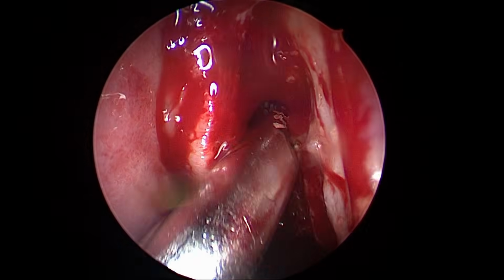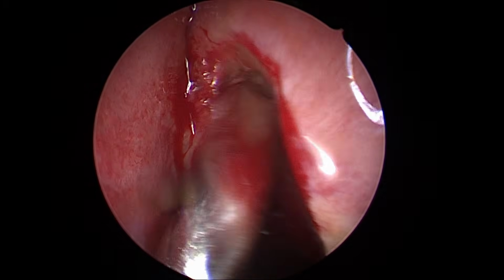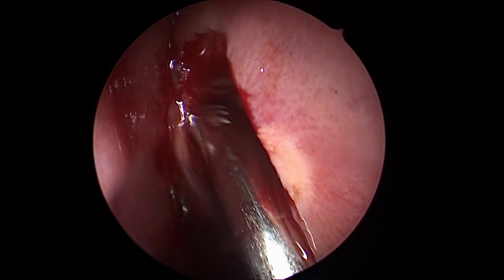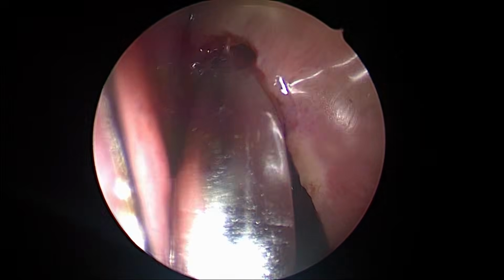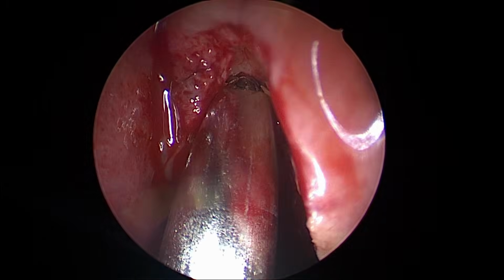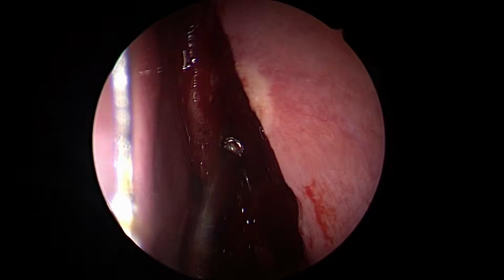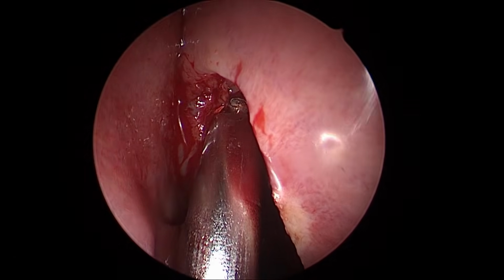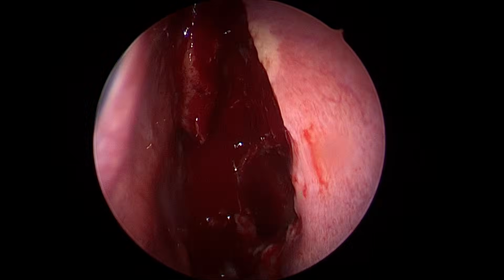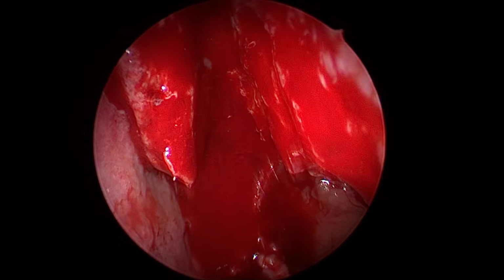Define your lateral limit, that is the lamina. See this? And the medial limit is your turbinate. We can't go medial to the turbinate to breach the skull base. And see what we have reached. Can you see the thick bone here? See with the 0 degree where I have reached. This much excess of the agger should be done. The moment you see this, I will change my scope. Give me a pack for a while. Simplest way of dealing with the frontal sinus.